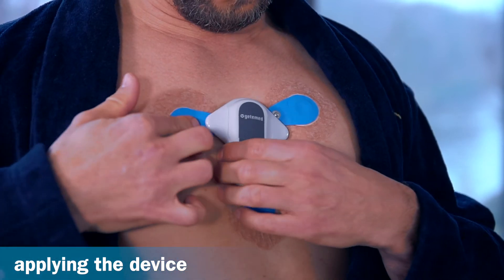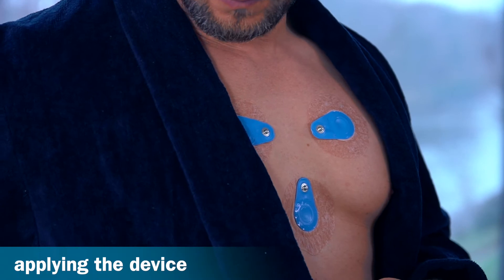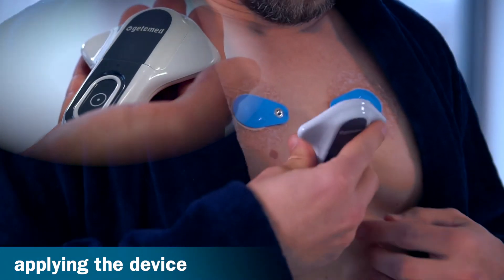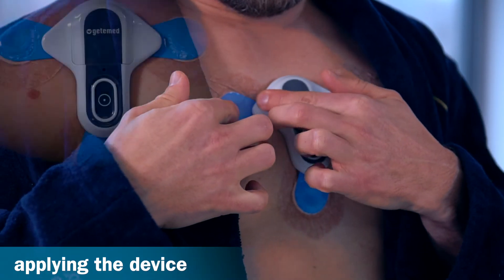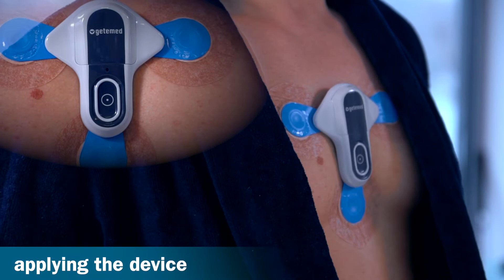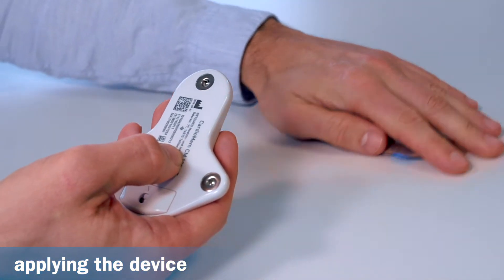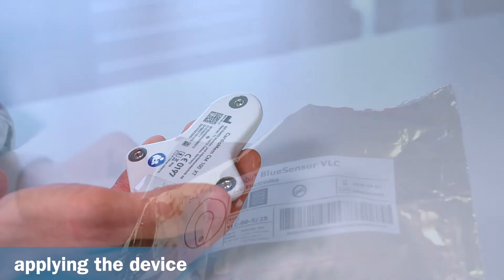Please remove the recorder before taking a shower and place it where it won't get wet. The electrodes can remain on the skin while showering. After showering, the recorder can simply be reattached to the electrodes — it automatically starts recording again. Please note: the electrodes are for single use only, and can be disposed of in normal household waste after use.